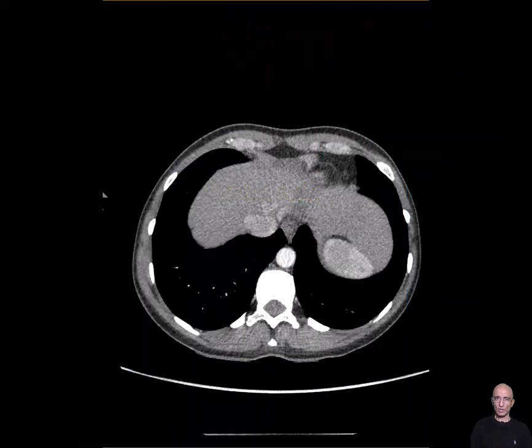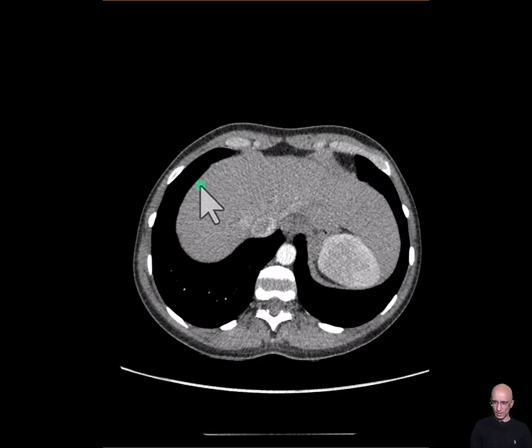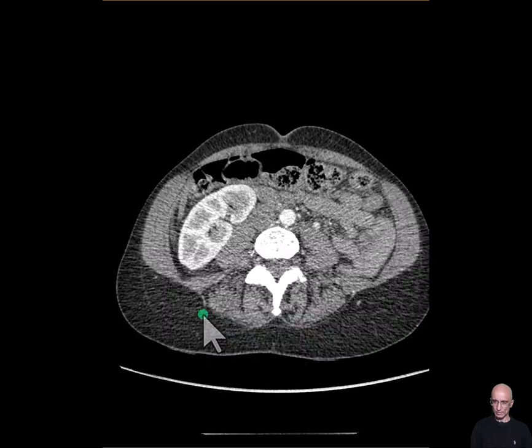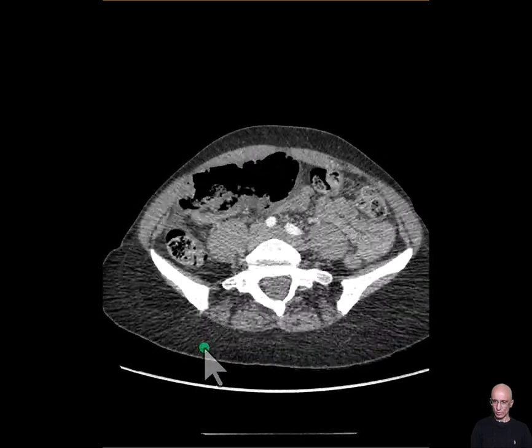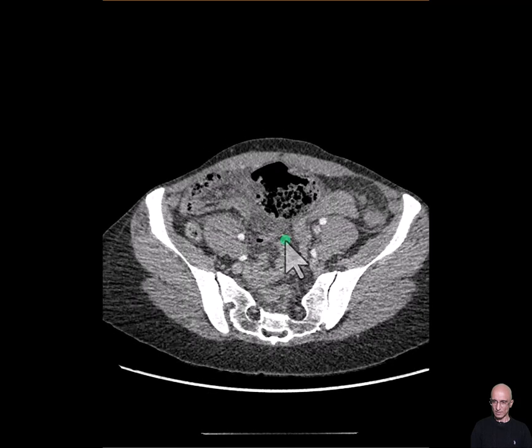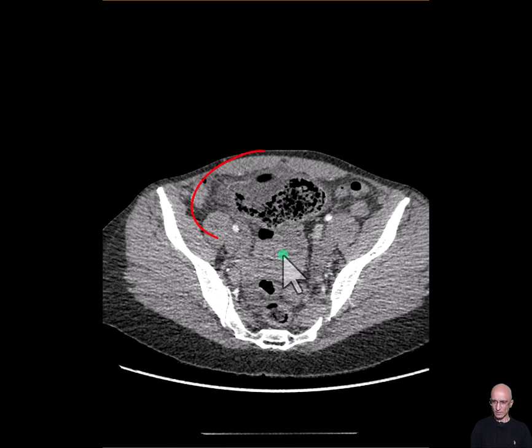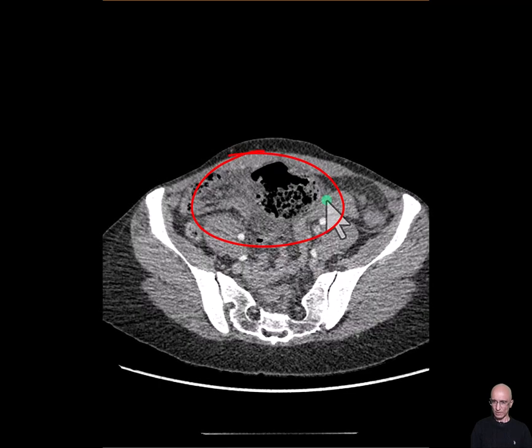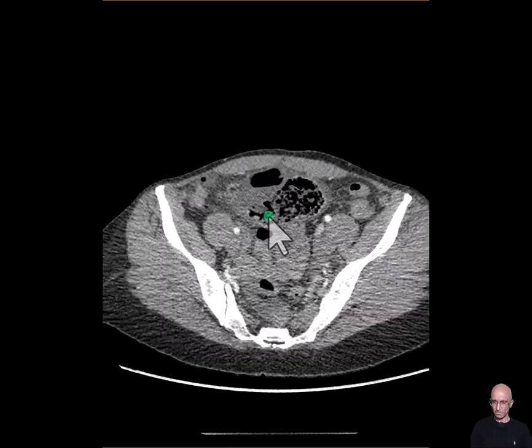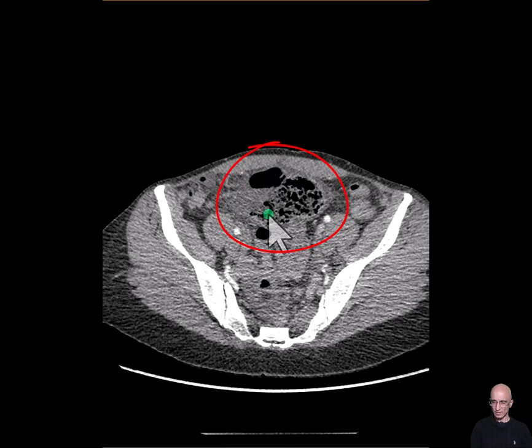I'm going to start with the axial images, scrolling from superior to inferior direction, focusing on the right lower quadrant. We see a dilated viscus which has got a thick wall with surrounding fat stranding. As I scroll up and down, this is the terminal ileum and this is the region of the ileocecal valve. This viscus is the cecum, which is abnormally positioned.